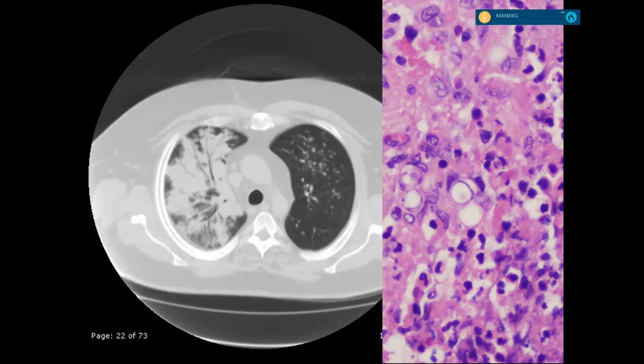Dense consolidation, unilateral. Right, and there's some on the left side. Is that broad-based budding with the two things on the right? So it is, Blasto. You got it. See, there's a mother and a daughter. I don't know which one. They're both the same size, so either one could be the mother.